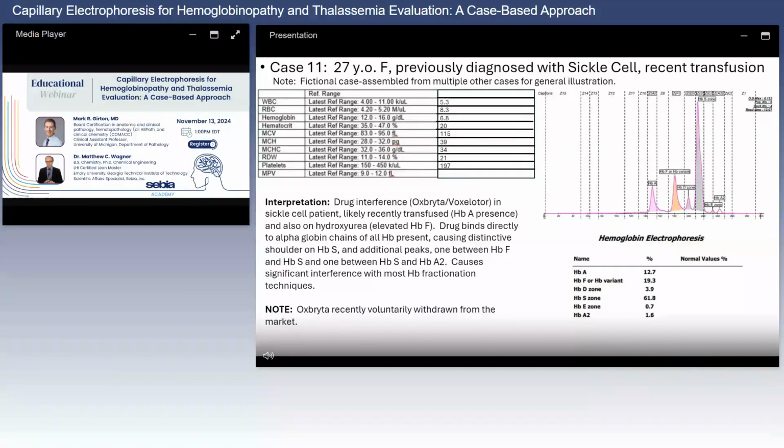We first encountered this particular profile when it began being sent into our result interpretation escalation group, and we were just as puzzled as anyone else because we happened to be getting samples from those patients who were in the clinical trial for this drug. The drug was subsequently approved and went into general use, and we began to see a lot more of this particular interaction come in for assistance. However, very recently, just within the last month, this drug has been voluntarily withdrawn from the market.